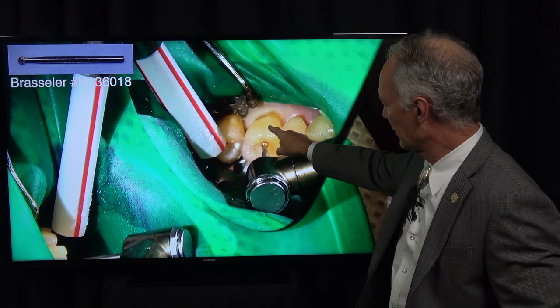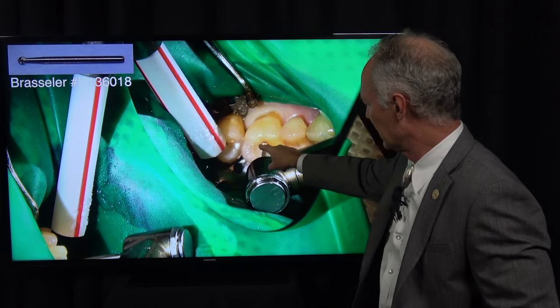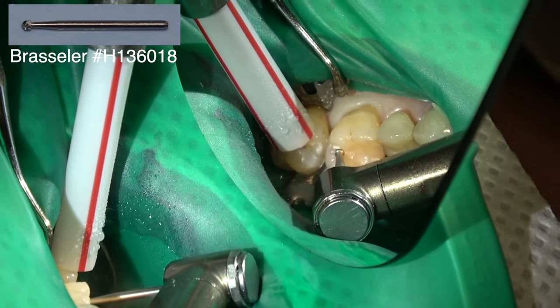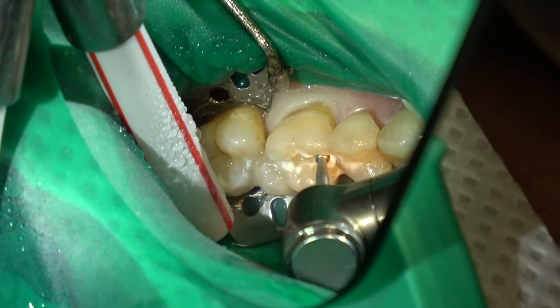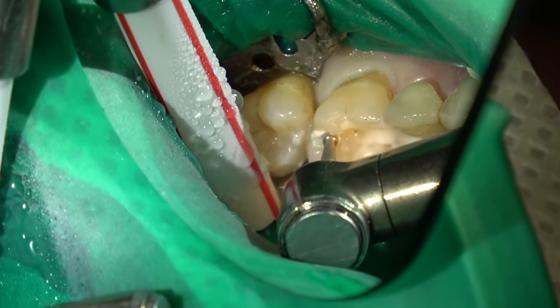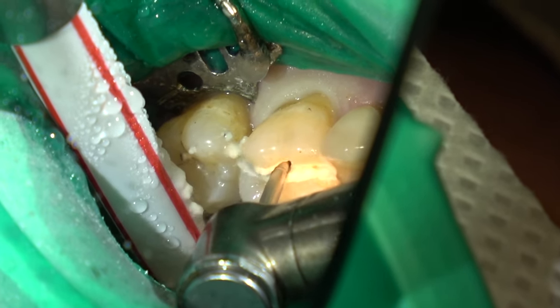You've got a mesial buccal root, a distal buccal root, and a palatal root. So I'm going to make a cut through here and through here, separating those three roots. Then I'm going to torque them just a little bit and take each root out individually, with the objective being to preserve the buccal bone and the palatal bone.